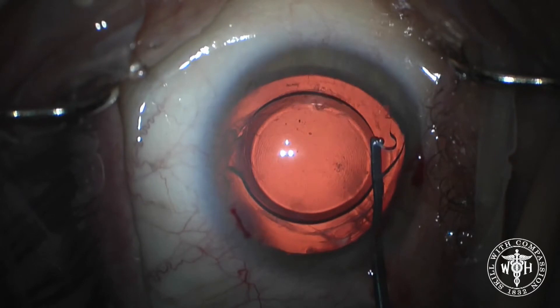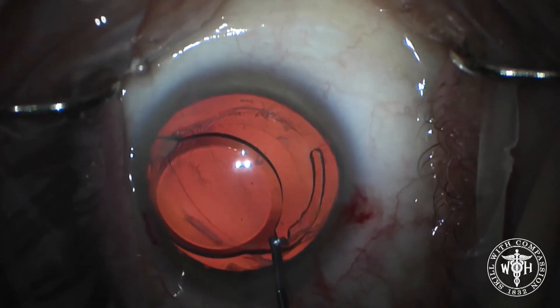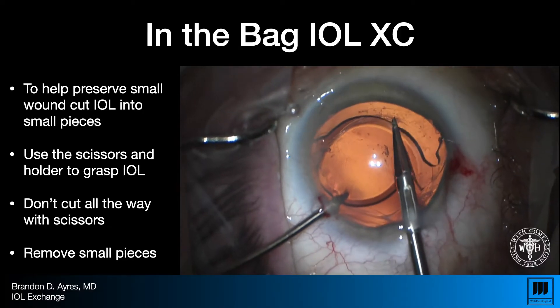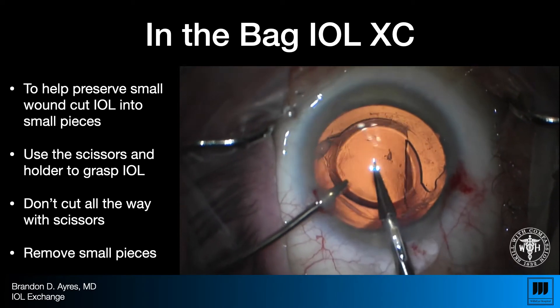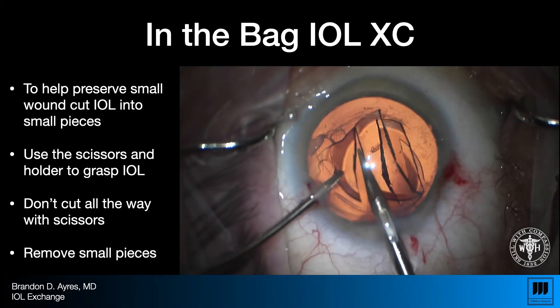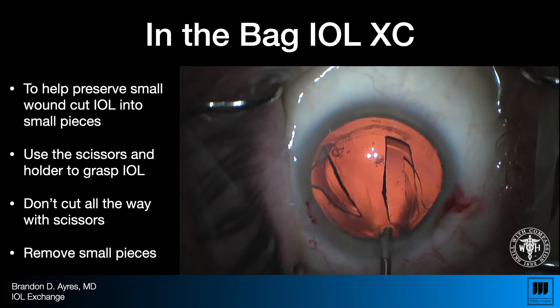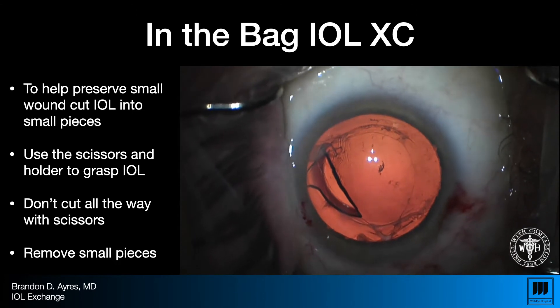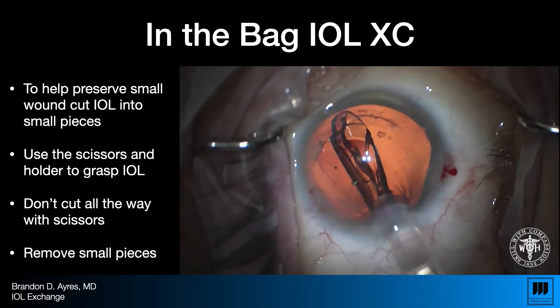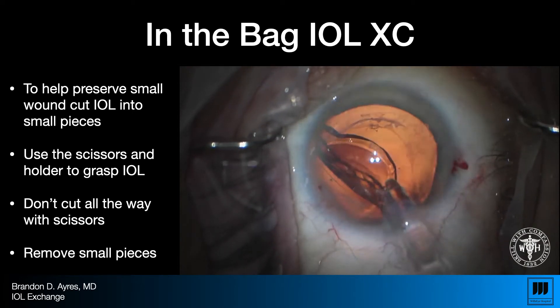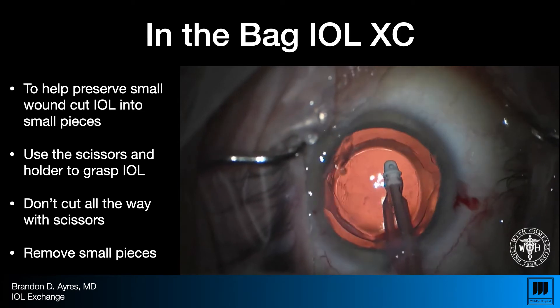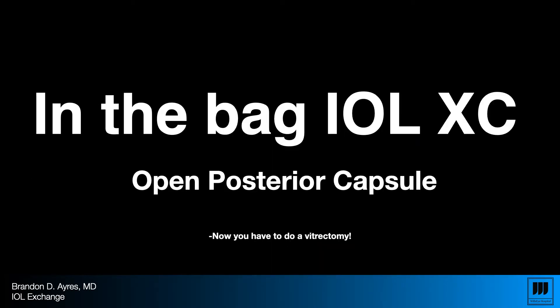Once you get things freed up, lift the IOL up into the anterior chamber, making sure you've fully visco-dissected the haptics. Then go in with the scissor and a micro forcep — both working together. The scissor holds, the holder holds, and you can use both hands to cut the implant. Don't cut the scissor all the way through — leave it a little bit open so it doesn't close inside the IOL, which makes it hard to find the cutting track. Go a little slow. Then put the new implant in the capsular bag, taking the old one out in small pieces.